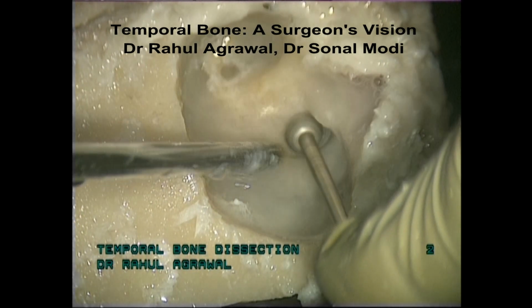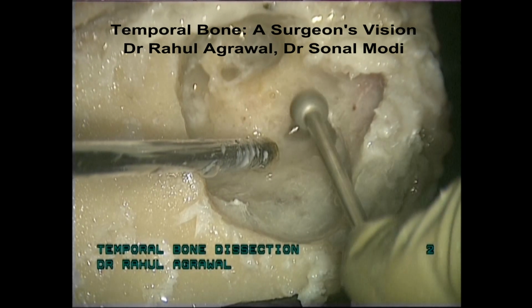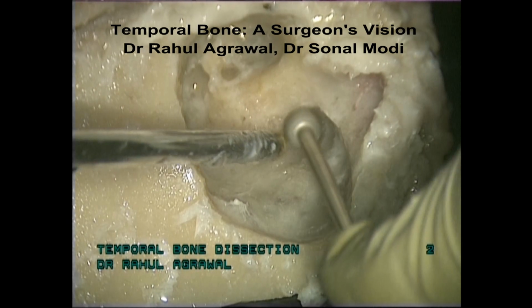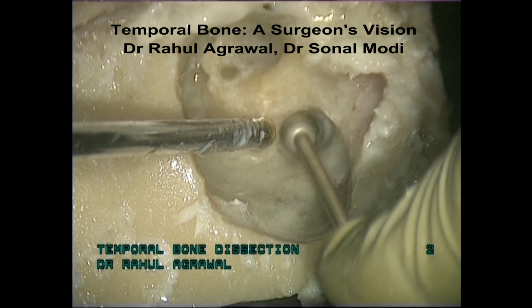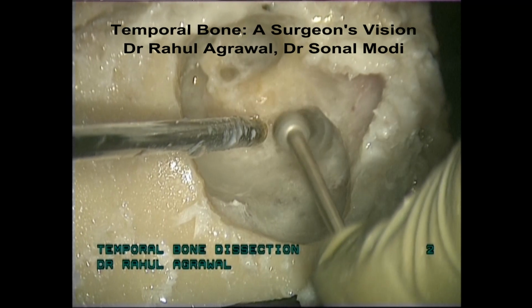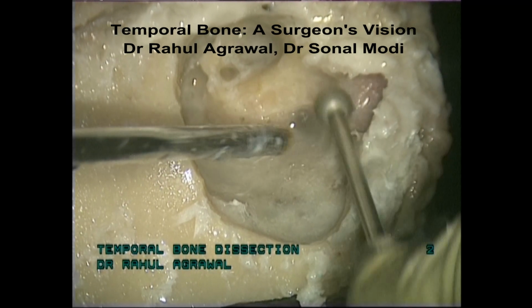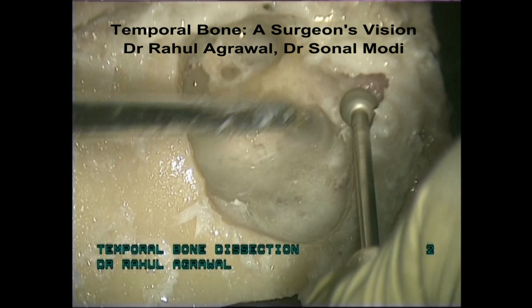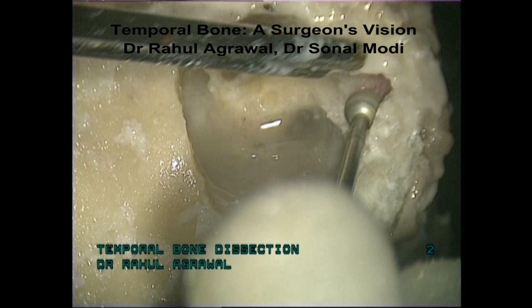When you're drilling in the retrofacial area, be careful that your burr point doesn't damage the facial nerve from its undersurface. That's the retrofacial area being drilled. Those are the lateral tip cells being removed.